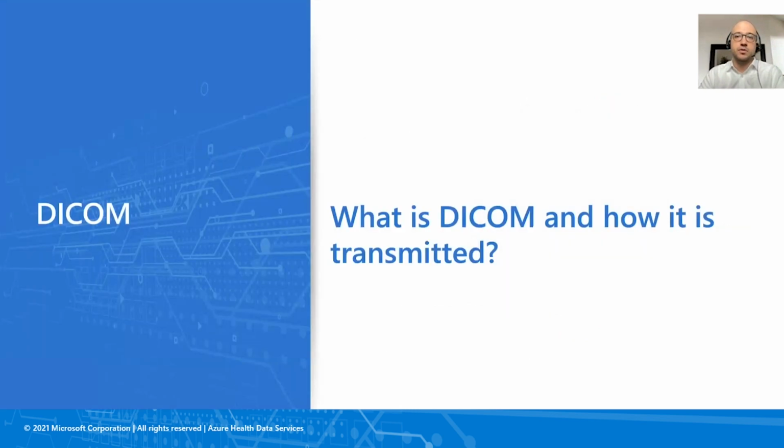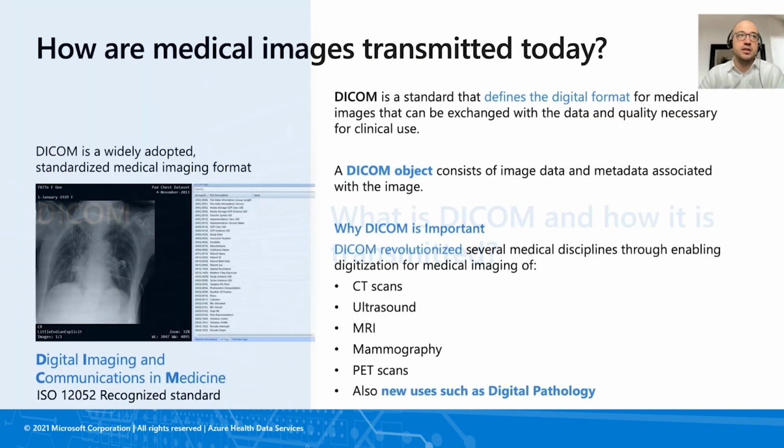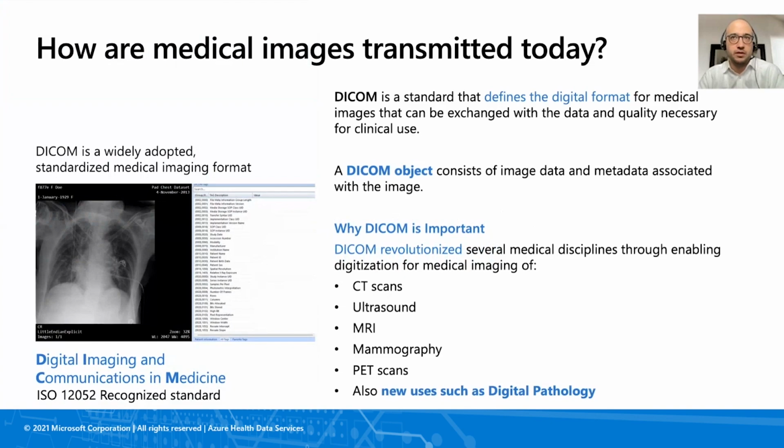Before we dive into the capabilities that we have in Azure Healthcare APIs, I would like to give you a brief overview if you are new in this area, especially what DICOM is and how it is transmitted. DICOM is known as Digital Imaging and Communications in Medicine. It is the international standard for medical images and imaging format and related information. In the DICOM standard, images are stored and transmitted between devices, such as modalities, picture archival and communication systems, vendor neutral archives, and more.